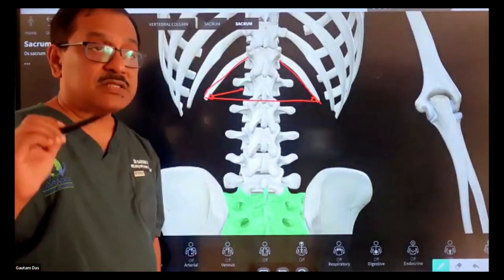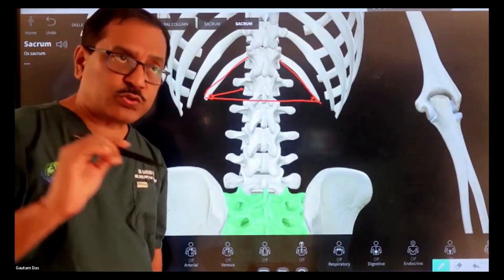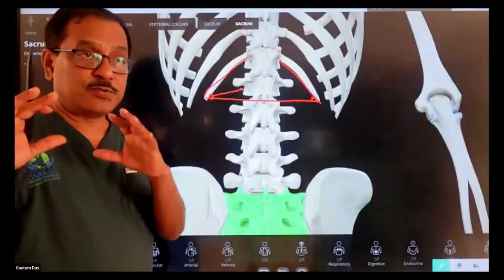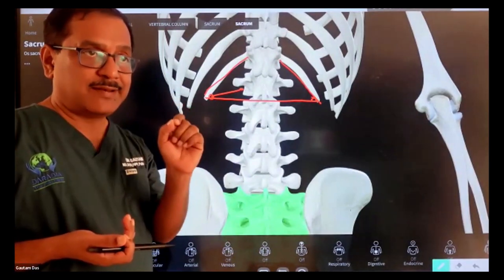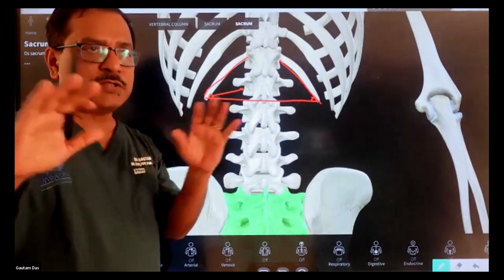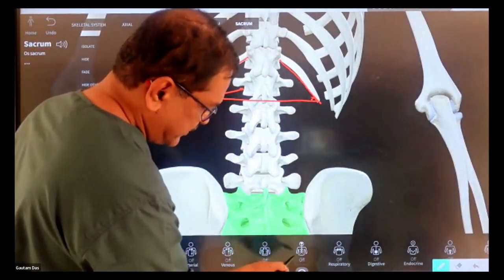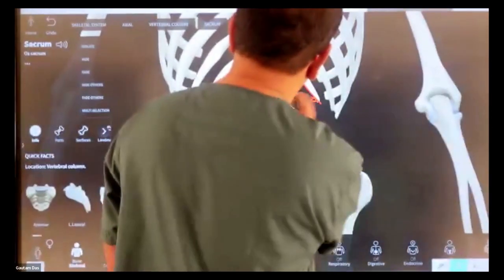But there, it is not the trans-aortic approach. If you are going through and through the aorta in the trans-aortic approach, then the success rate is much better. And we first published one important technique, how to do it, in the Journal of Pain in 2009. And that is one of the very common techniques of doing the trans-aortic block, not only in India, in many parts of the world. So how are we doing it? First, let me erase this drawing.